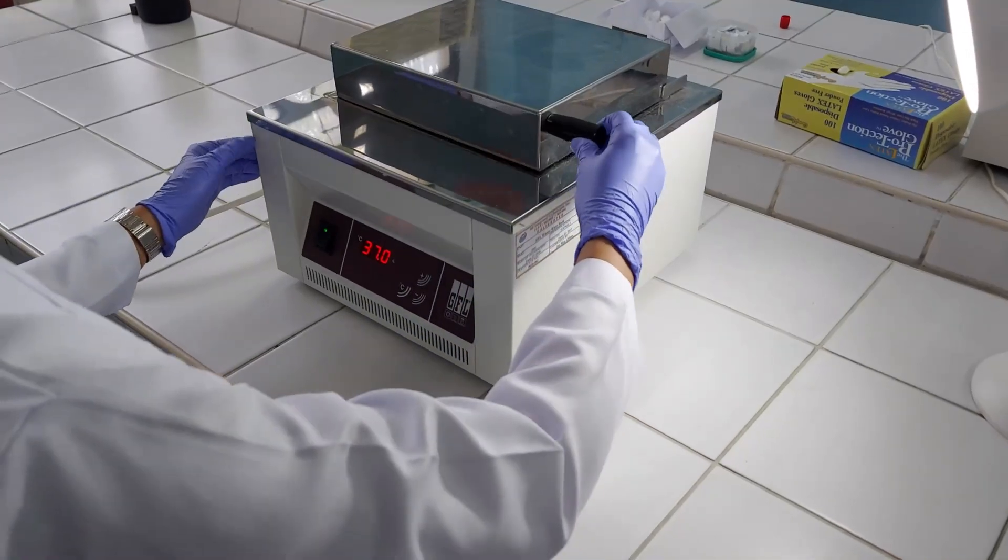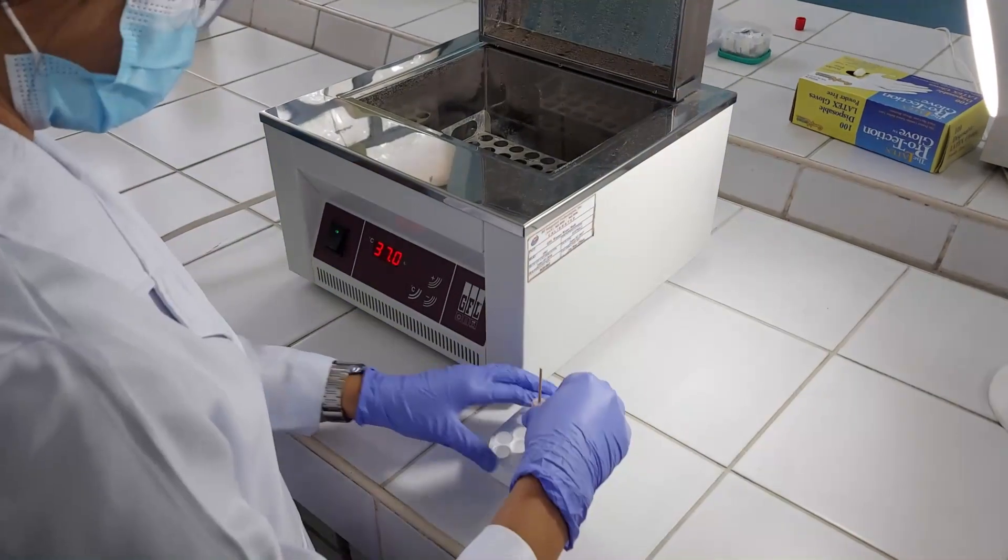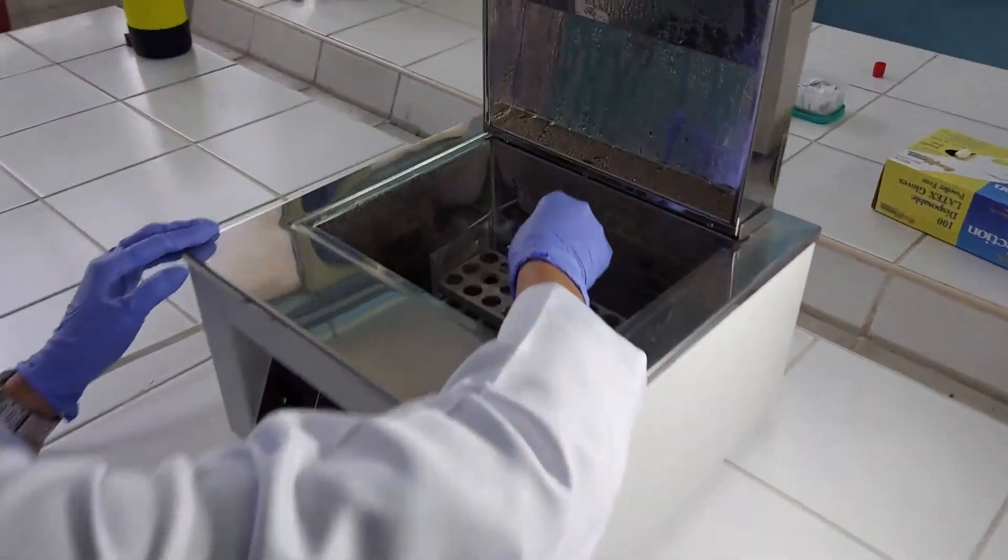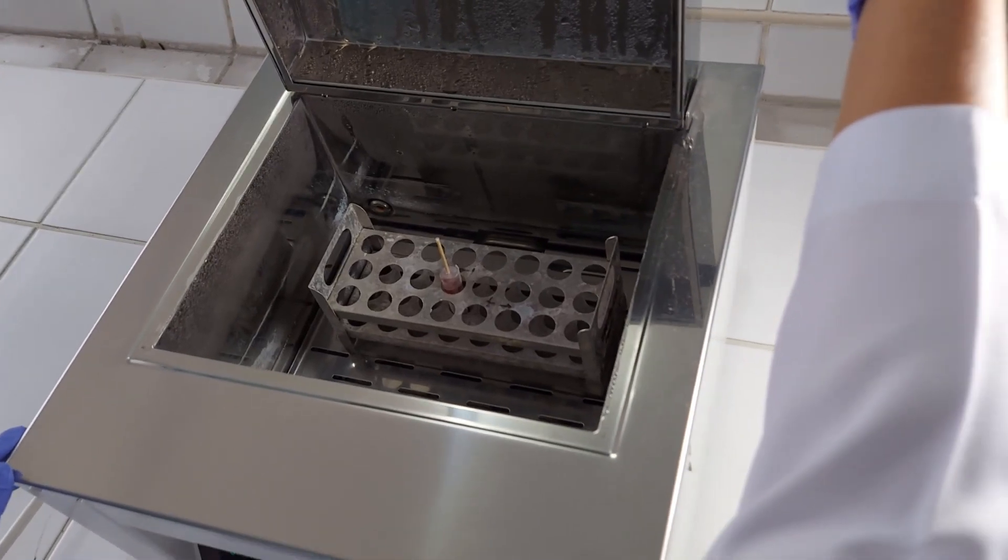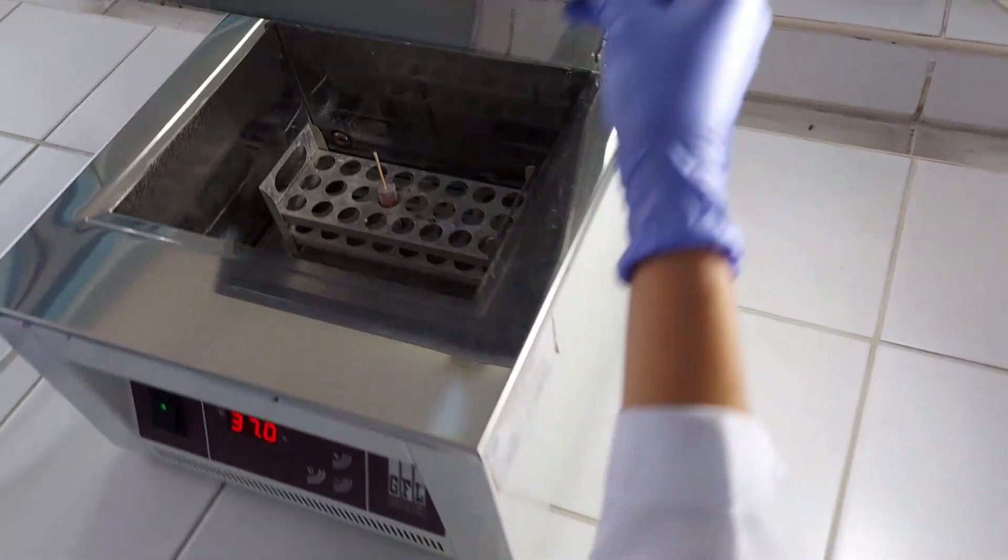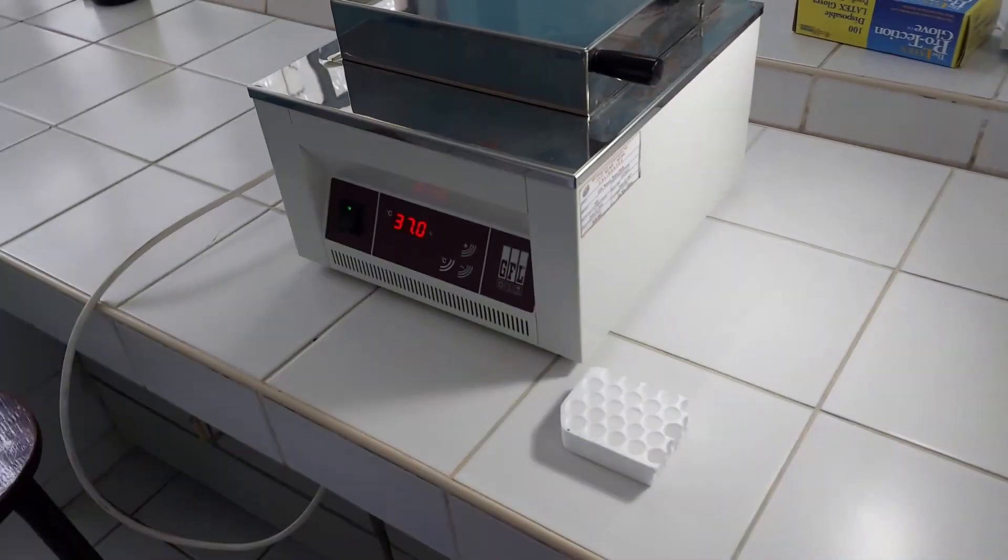Place the tube at 37 degrees Celsius water bath until clot retraction is observed. Clots formed after the first hour may be removed by passing an applicator stick around the inside of the tube and allow the tube to be incubated again for another hour.